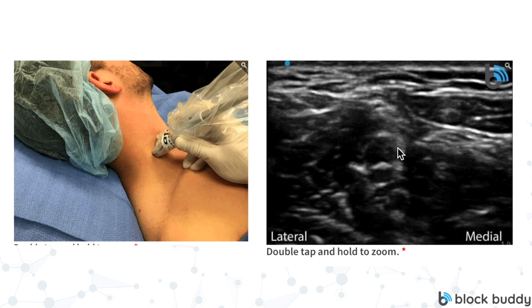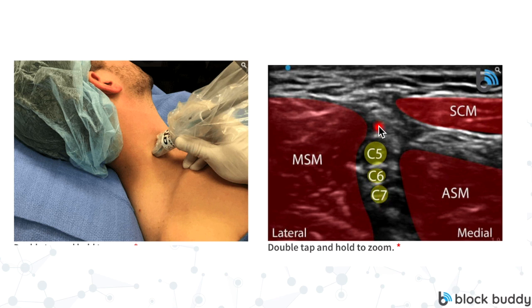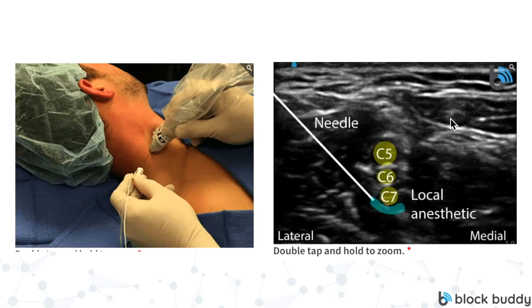Generally this is at the C6 vertebral level, which correlates with the cricoid cartilage. C5, C6, and C7 are going to fall into the gap between the middle scalene muscle — which is lateral — and the anterior scalene — which is medial. We're also going to have the sternocleidomastoid muscle on the medial side. Once we see this image, we're going to bring our needle in from the lateral side and start advancing in-plane within the beam of the ultrasound.